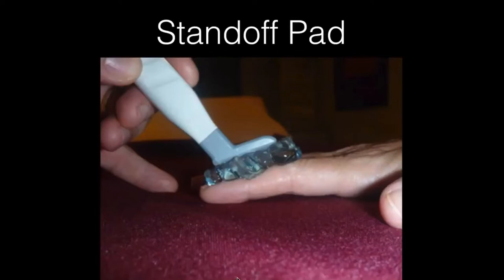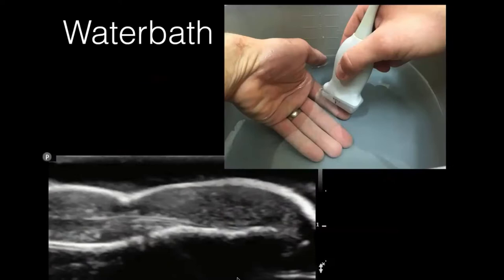Here's an example of a standoff pad, which works really well for abscesses. You can float the transducer over a pile of gel so it's not really putting pressure on the structure but still providing the coupling you need. The other option is a water bath — for things like evaluating a finger, it's easy to put in a water bath. Put it in water; the transducer head is generally watertight, and you can get coupling with just the water. Here's an example of my finger where you can actually see the finger down low in the image.